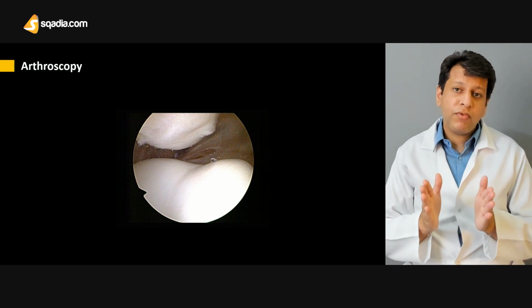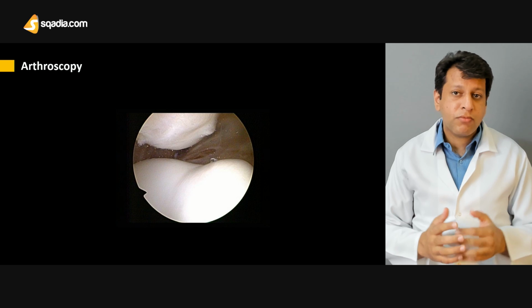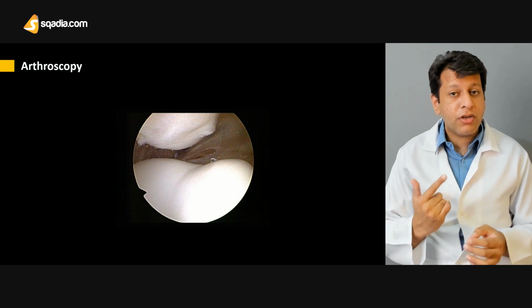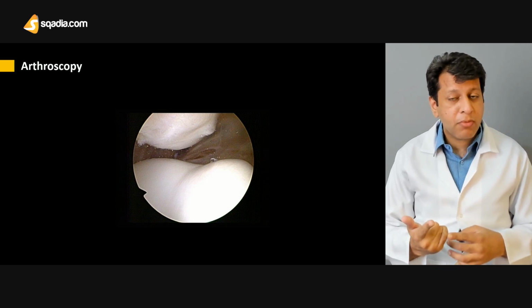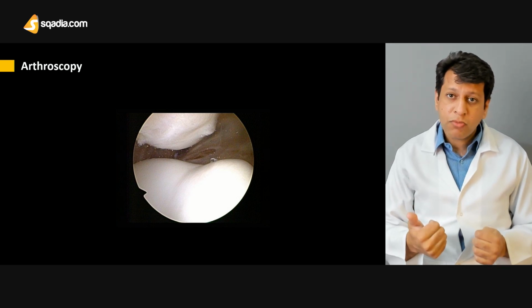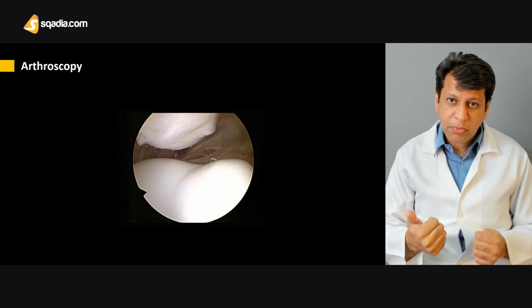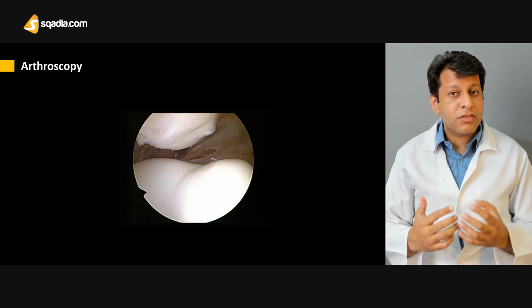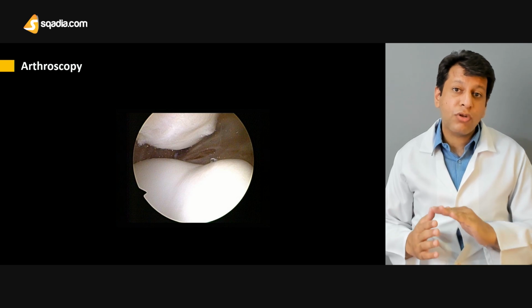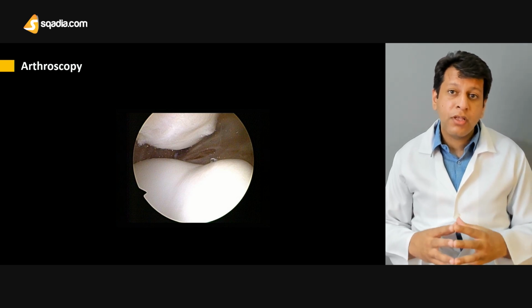So if we are suspecting patellofemoral pain syndrome, first and foremost are always the X-rays. On X-ray, we have to look for malalignment of the patella, fracture or dislocation. We may have to look for subchondral sclerosis and subchondral osteopenia. Then on CT, we may have to calculate the TT-TG ratio to exclude patellofemoral instability.